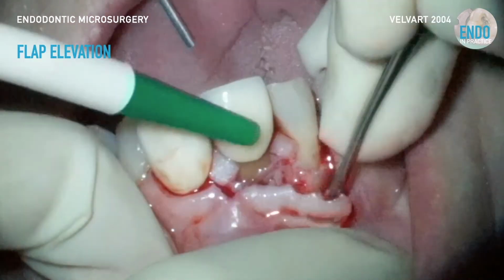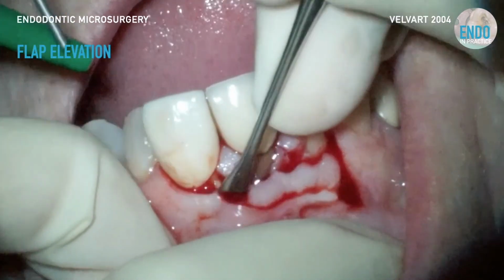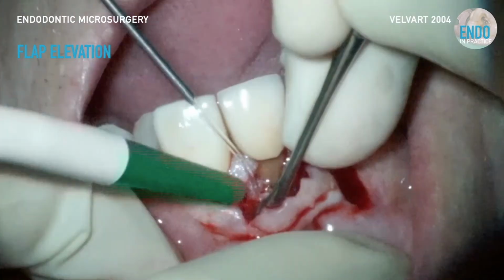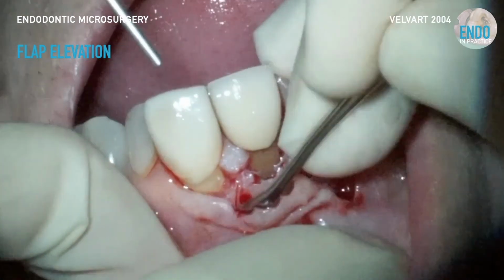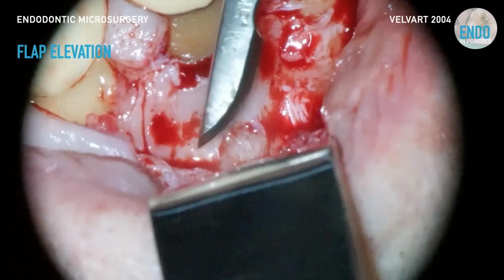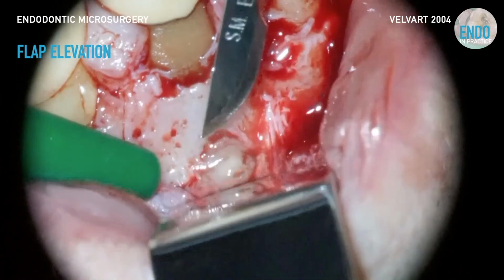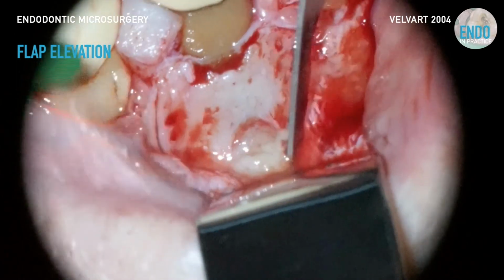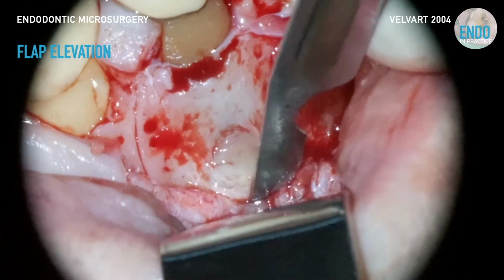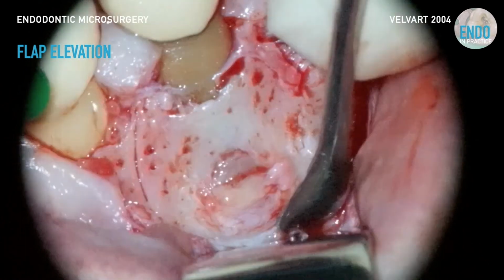This is a fundamental part of surgery. The light from the microscope will heat up your surgical site quite a lot and dry the tissues out, which will increase your post-operative discomfort and possibly soft tissue necrosis. So because I'm using the microscope for all the surgery, you really do need someone irrigating to keep the tissues nice and cool, and it also helps keep the field of vision clean.